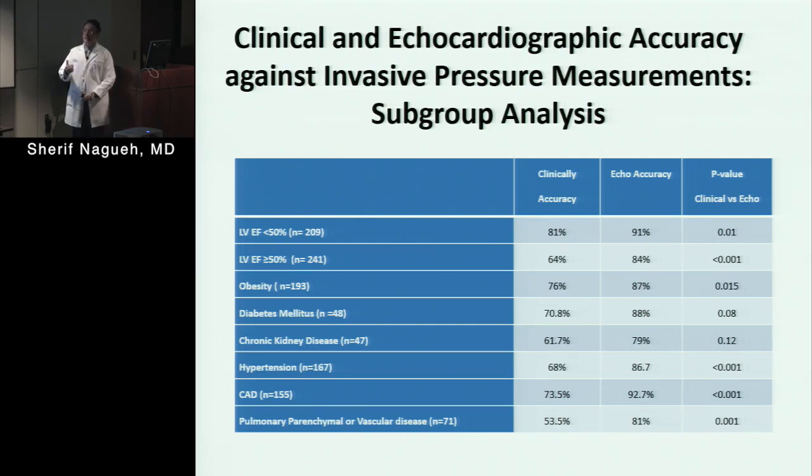So all you need is a clinical diagnosis of heart failure plus an echo that tells you EF is normal. You don't need anything else. And you can see that this failed in 36% of the cases. You can argue how good the clinical assessment was. It is as good as those who are doing it. But that's a situation which I think is probably even better than the real world setting. It's interesting because, as I recall, one of the studies to define heart failure was the response to therapy, to diuretic.